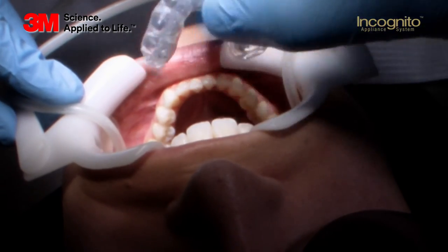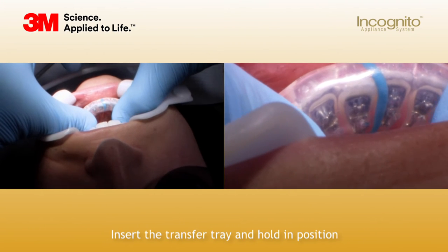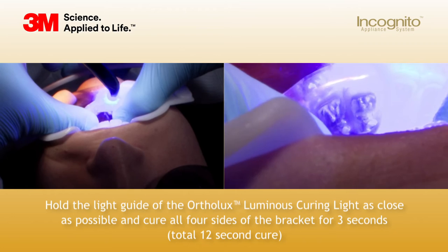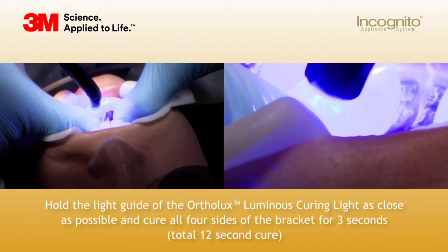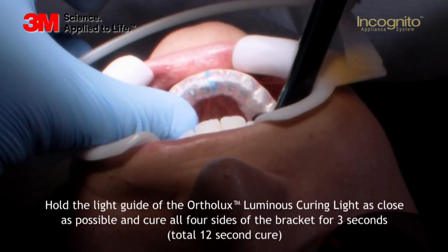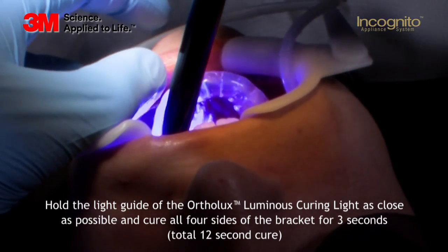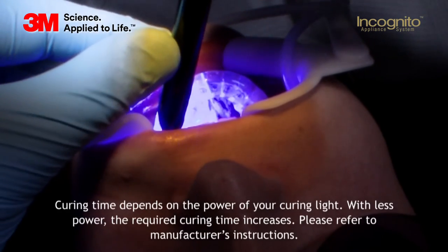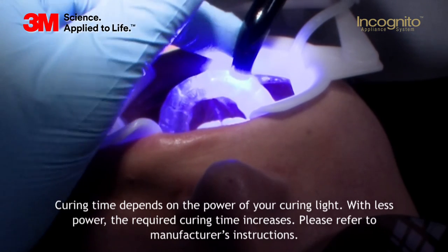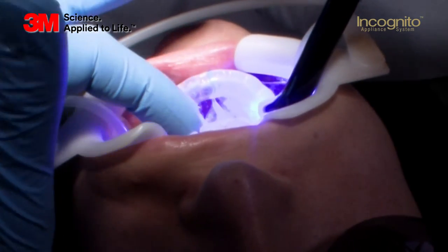I take the tray and put it in the patient's mouth. Verify the fit, push it down, let it settle, and ask your nurse to cure it on the anterior labial surfaces first. You will cure every single angle of the bracket for at least three seconds. After the initial curing, you have the time to go to the premolar area and cure it there as well. Three seconds for every single tooth from each angle. Always make sure that you cure from the labial side to the lingual side, as we have a metal bracket and it's impossible to cure through the metal.